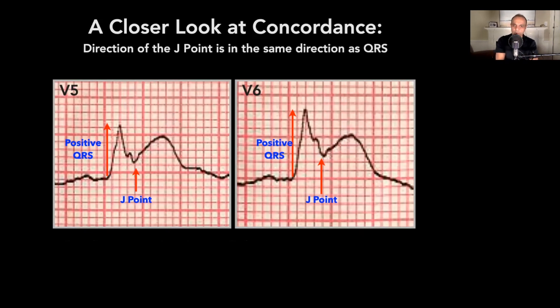For example, in V5, the QRS goes upward — it's positive — and the J point is elevated also. Here again in V6, the QRS is positive and the J point goes in the same direction. That is called concordance: positive concordance.